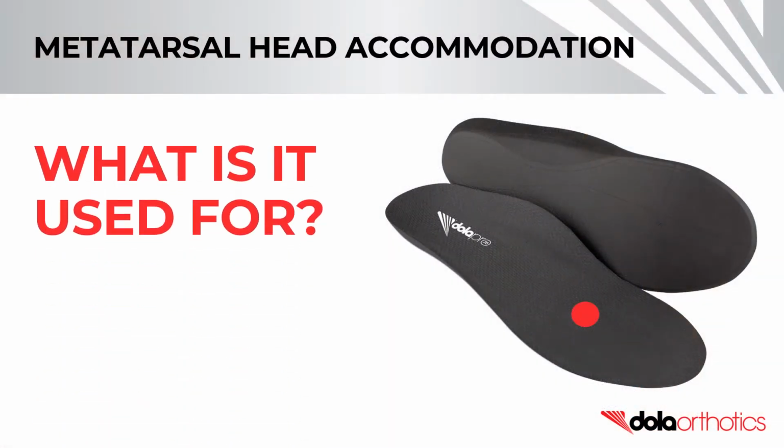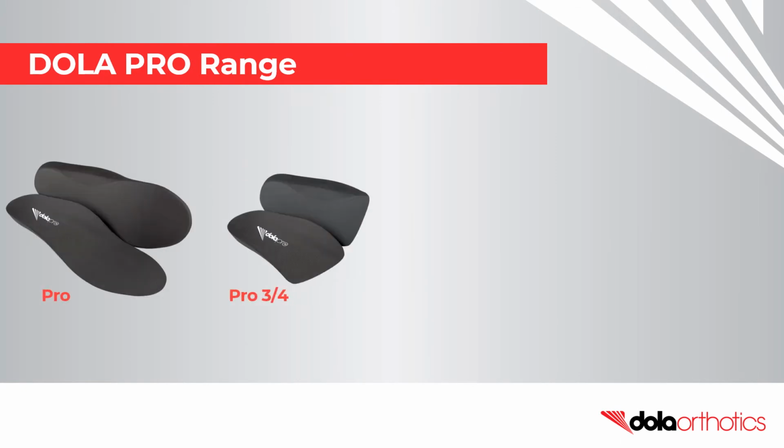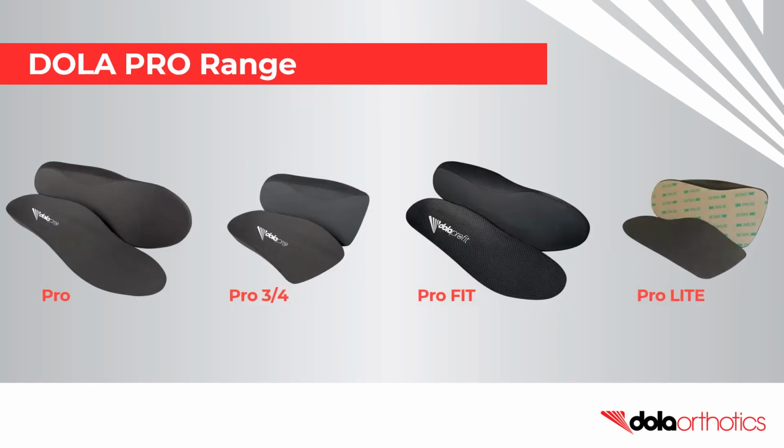A metatarsal head accommodation is used to accommodate structures in the dorsal surface of the orthotic including nodules, plantar warts, corns, exostosis, scars, or rigid deformities. It can also be used to address pathologies including capsulitis or bursitis, and to improve comfort, tolerance, and troubleshoot orthotic irritation. Fit customizations can be performed on the entire DOLA Pro range. If you don't have a grinder, the Pro Fit and Pro Lite are popular low-profile options.